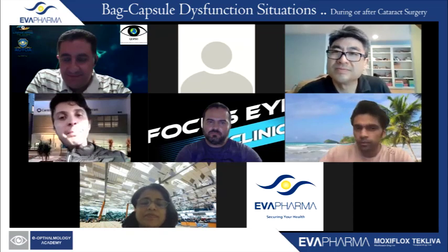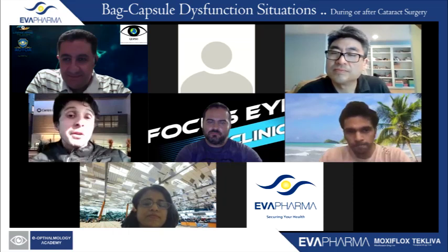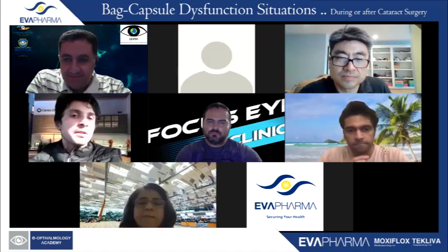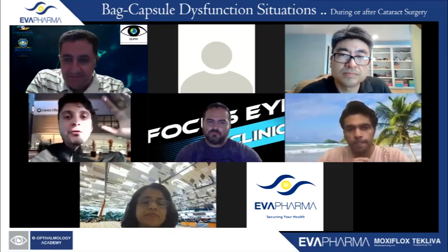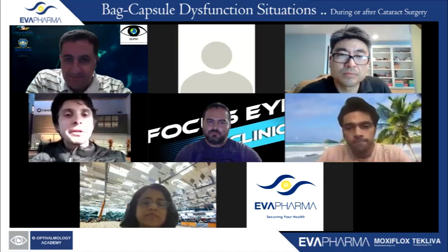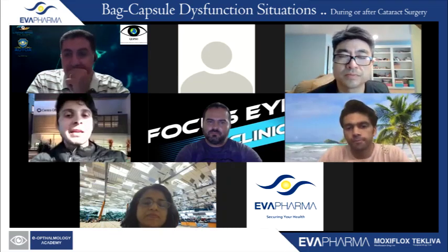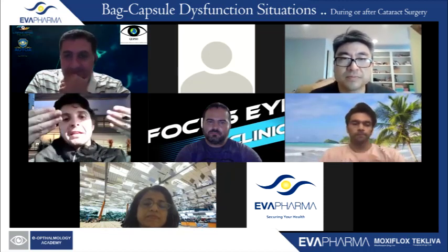In all my patients, I do it with a retinal vitrector, as a retinal surgeon. And then, like in this case, I tried to levitate this case because there's no vitreous in the anterior chamber. The zonula was intact, with fragility, but intact. Then I show in the green arrow how I send the air bubble, and the air bubble doesn't pass the zonula. Then the air bubble levitated the lens for me.